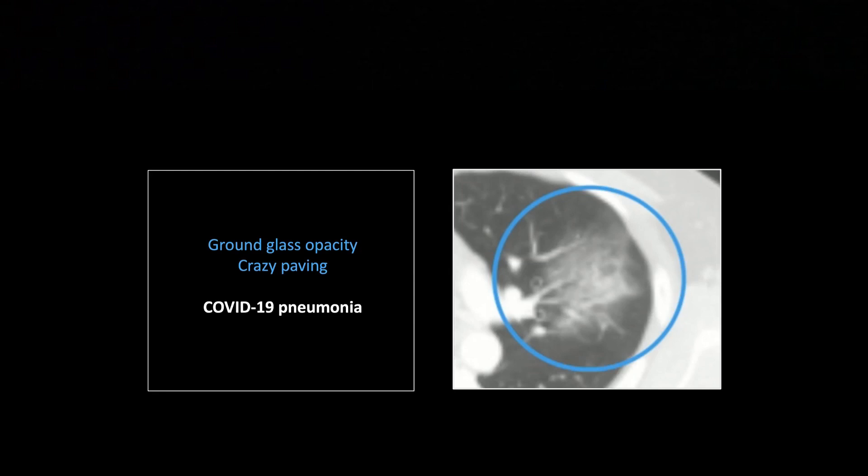Ground glass is defined as parenchymal density, lung density that still allows you to identify underlying structure. If you look towards the anterior portion of this parenchymal density, you can see vessels still running through that area of alveolar density. That is the very definition of ground glass.